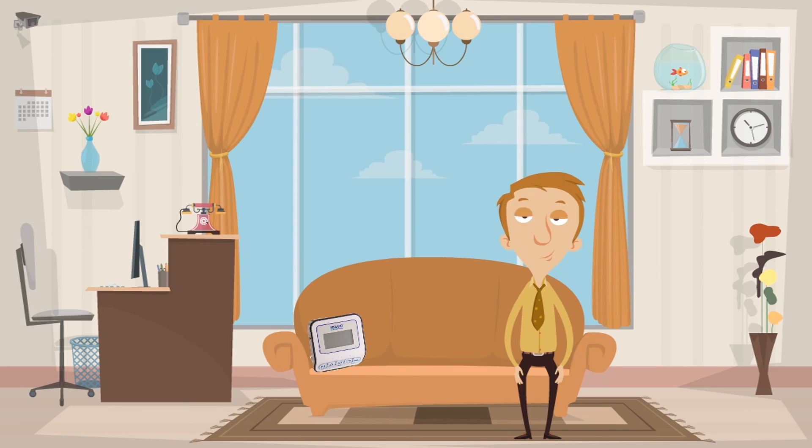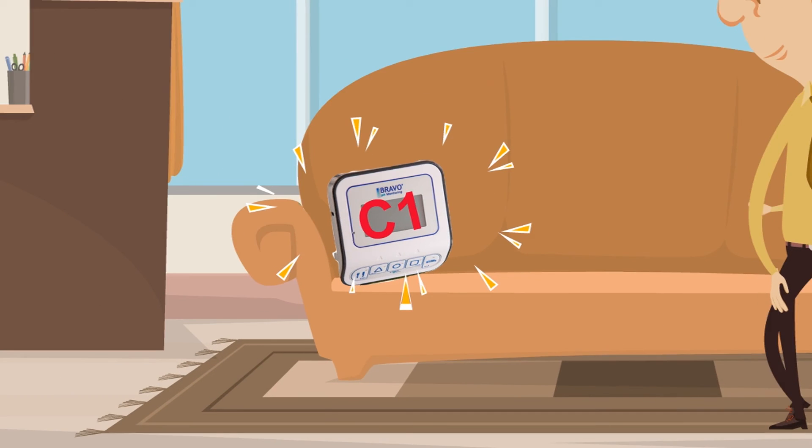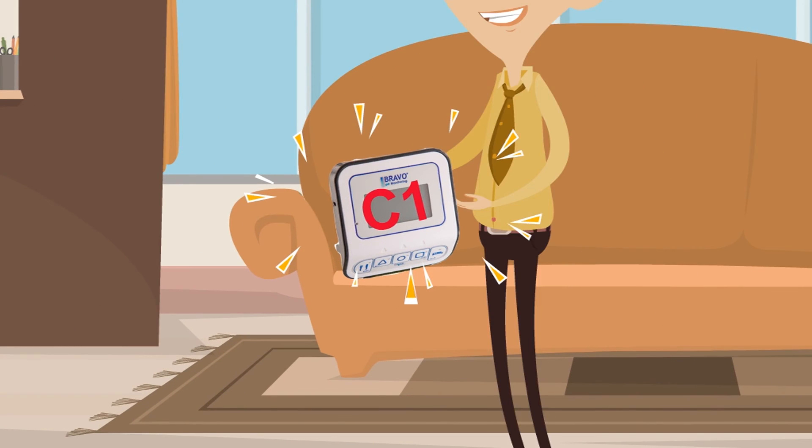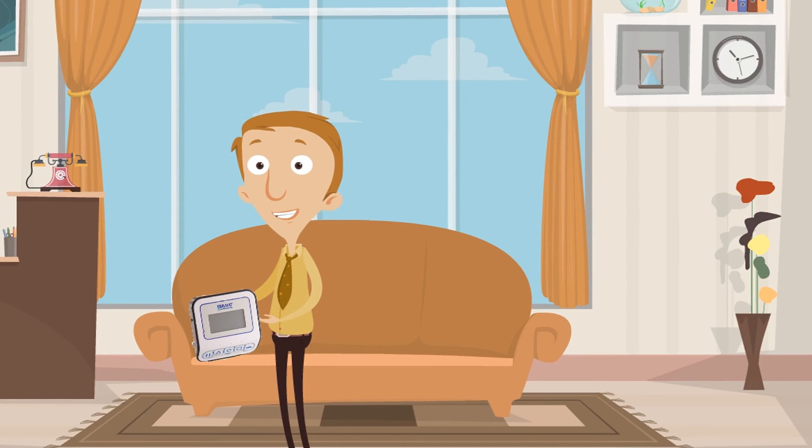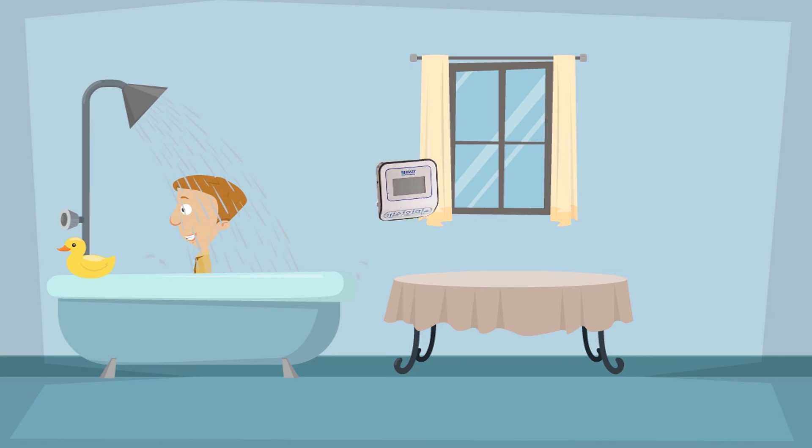The recorder must stay no more than three feet away at all times — about arm's length. If the recorder is too far away, it will beep for 30 seconds and show an icon saying C1. If this happens, place it next to your chest for 30 seconds and recording should resume. Please note that the recorder is not waterproof. Place the recorder on a stable surface right outside the shower.